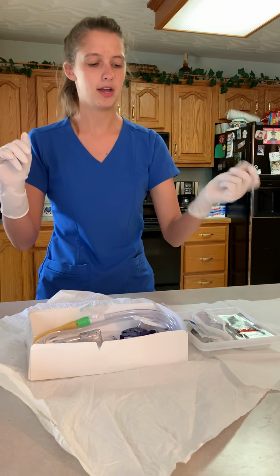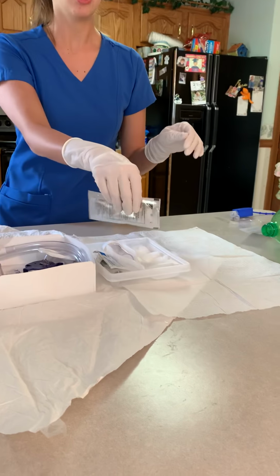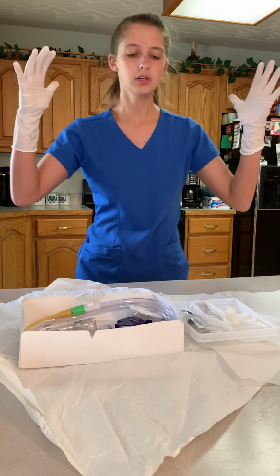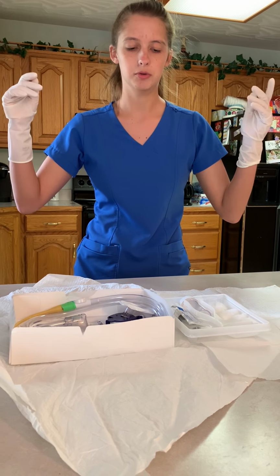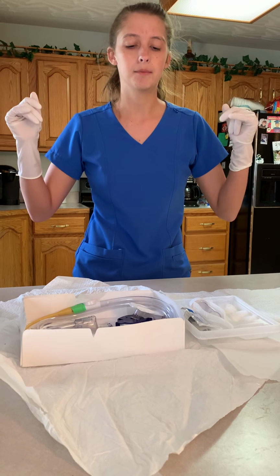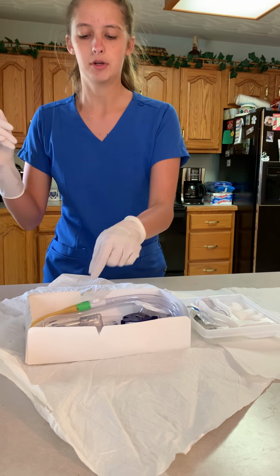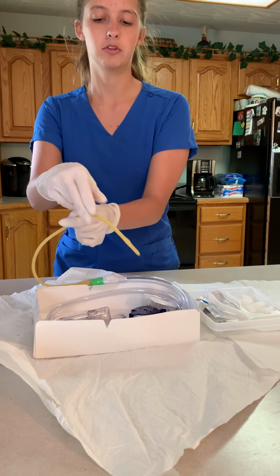Okay, so now first I'm just going to pour my betadine onto my cotton balls. And then we're going to go out and away from the sterile field. And now, since I have two sterile hands, I'm going to lubricate my catheter tube. So I'm going to pick up my tube. Again, I'm not going to cross over my sterile field.